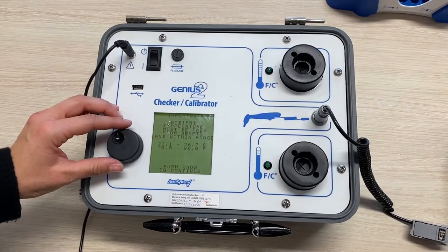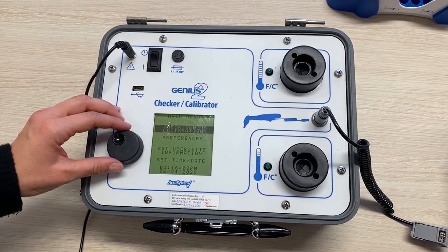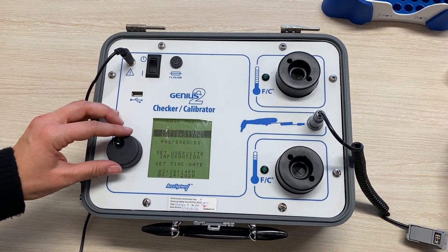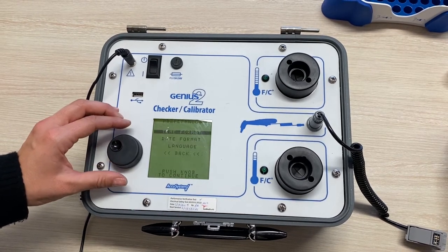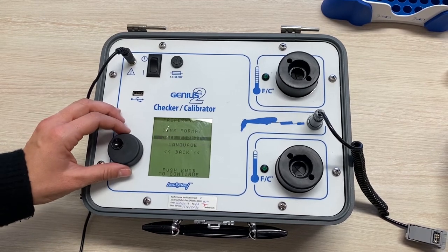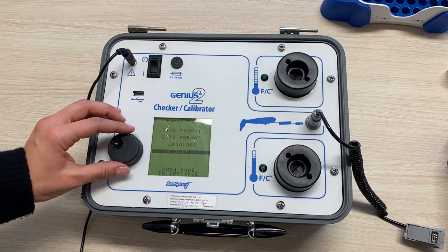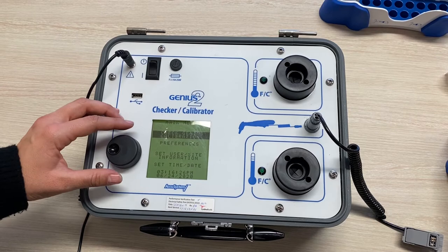Once the 15 minutes is up we can continue by pressing down on the main knob. This is the main menu. You use the main knob to toggle up and down and press down to select. Under preferences there is the option for language selection. You can also select time and date, but most of the time you will just want to calibrate a Genius unit, so you will select the first option.